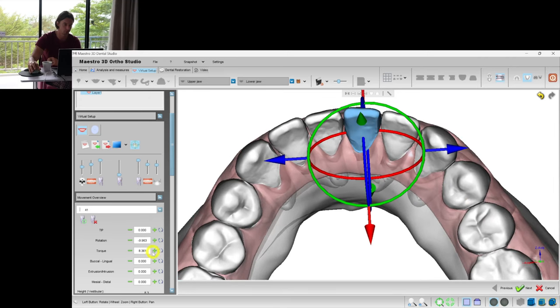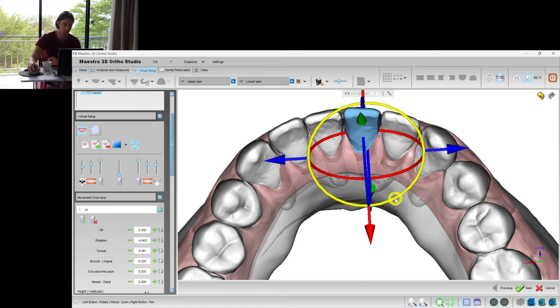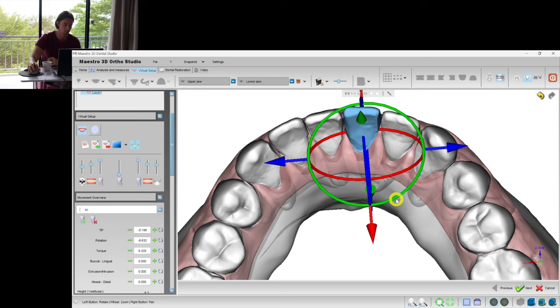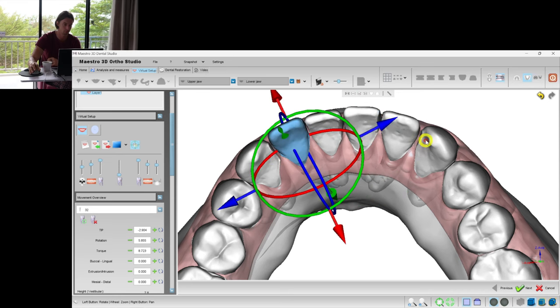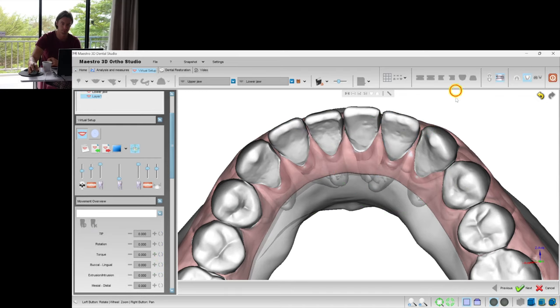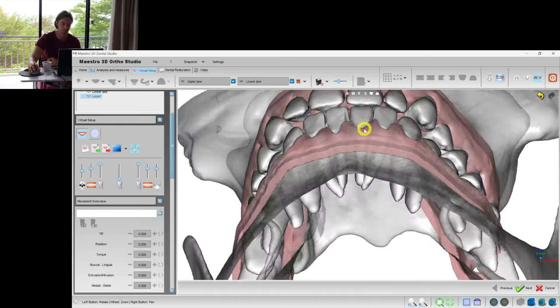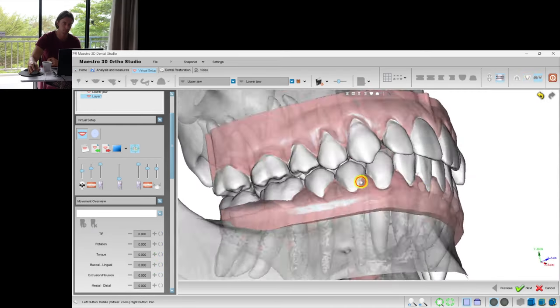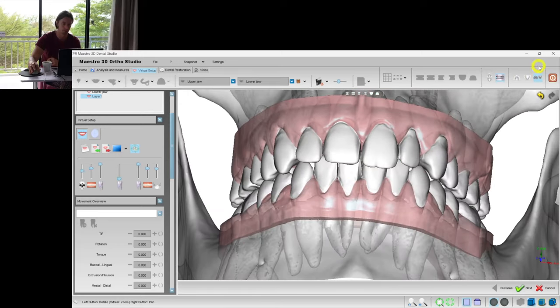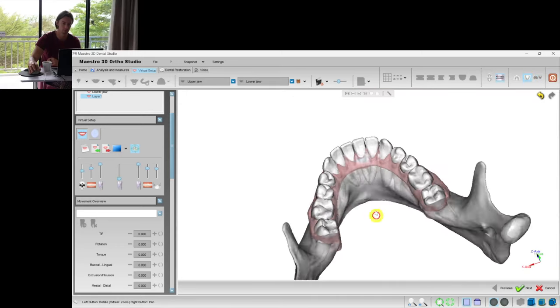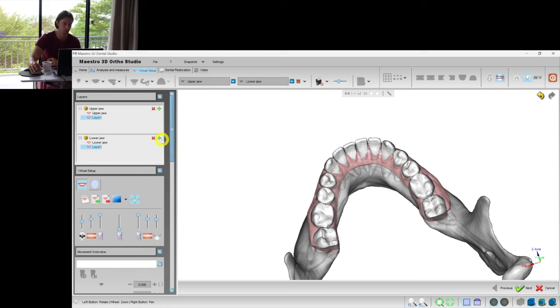So if I see that the rotation goes faster than the proclining, I reduce the rotation or I increase the torque. Well, I think we're done with the layer 1. Now let's create the second layer.